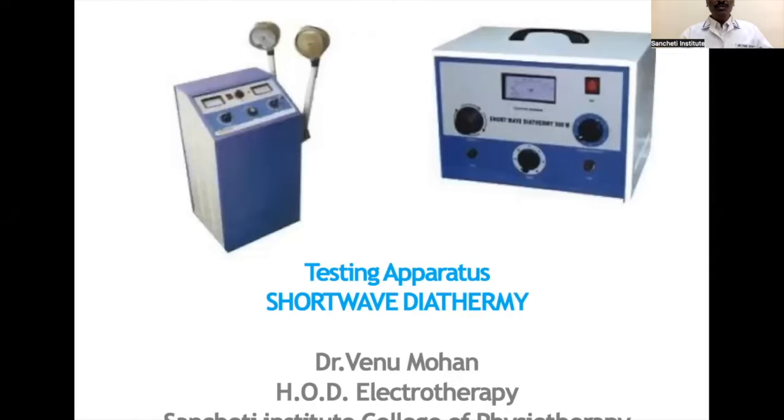Today we are going to discuss testing the apparatus, which is part of the syllabus of first year BPTh under the MUHS. Let me share the PowerPoint. Shortwave diathermy is one of the very useful apparatus in treating patients. It is present in almost every physiotherapy clinic and is one of the deep heating modalities we often use for treating our patients.